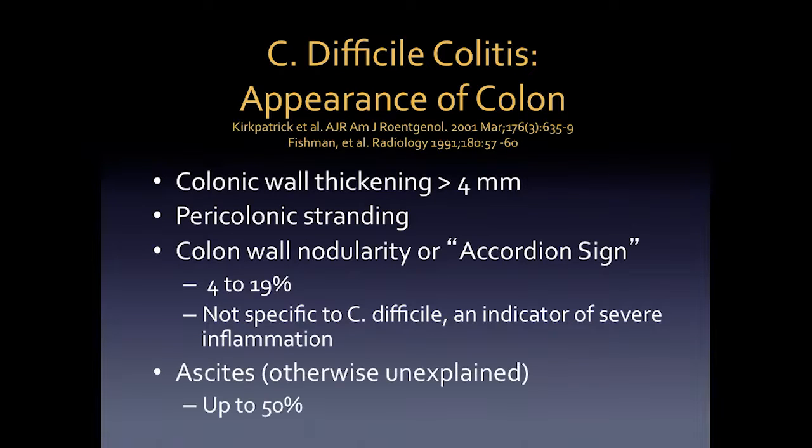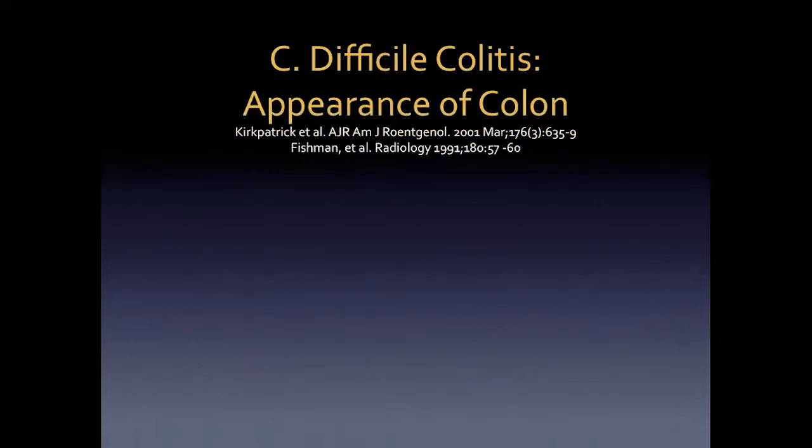Also ascites, and of course, otherwise unexplained. So not a patient who has cirrhosis and portal hypertension, but you have ascites in about 50% of cases with positive C. diff. And of course, the more severe the inflammation is, the more likely you are to have associated ascites.